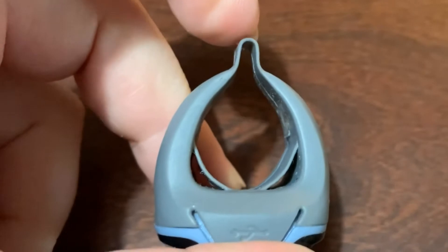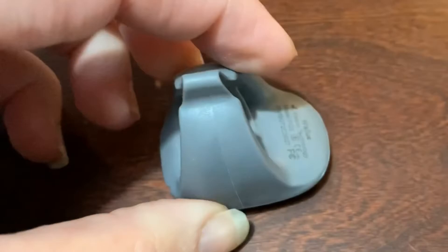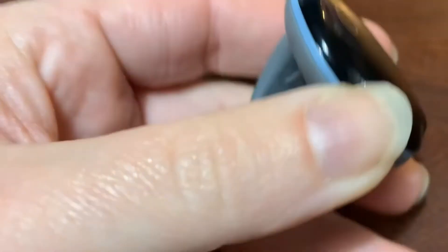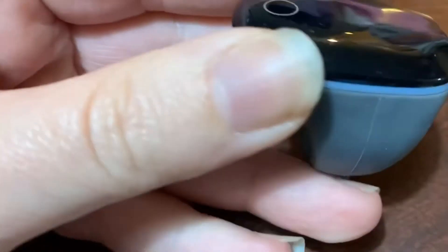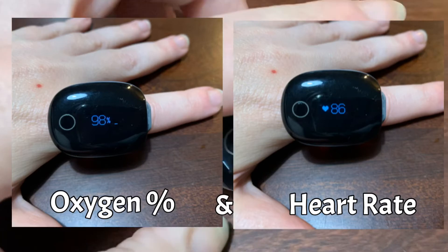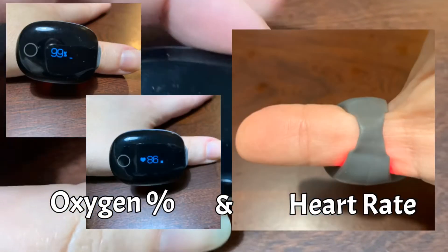It looks really thin here but it's not going to break, and it's comfortable enough to literally sleep in and not even notice it's there. I put this on with the little circle piece right here and I like to wear it on my pointer finger or my thumb generally.